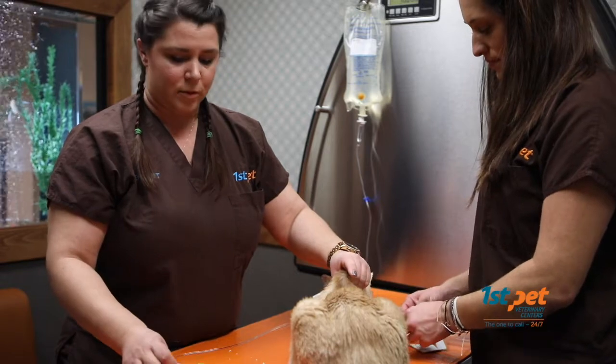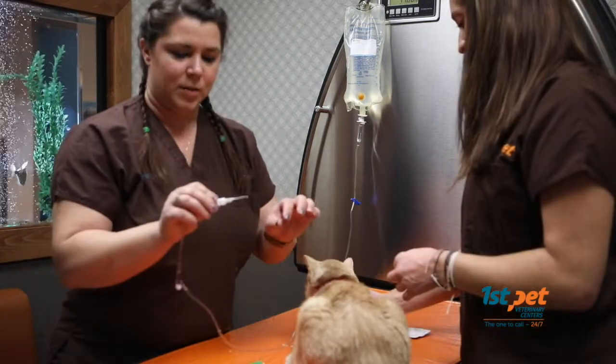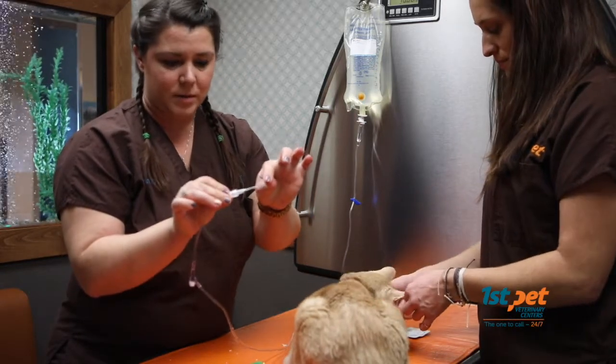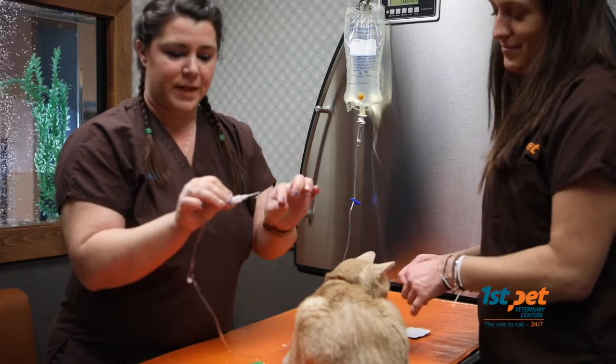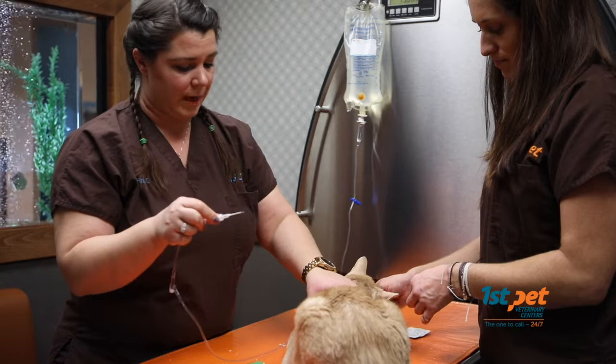When you're ready to give the fluids, you'll want to take your cap off. You want to make sure that when you're looking at the needle, you have the opening part, it's called the bevel, facing up. This is for ease of comfort when you're giving the fluids to your pet at home.